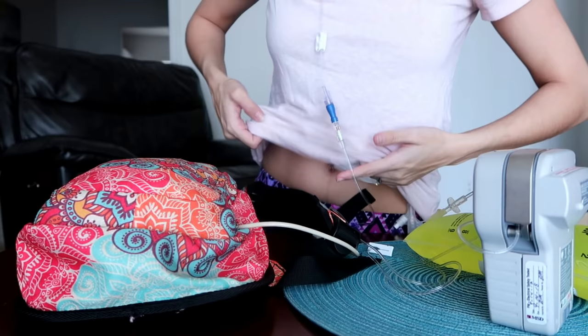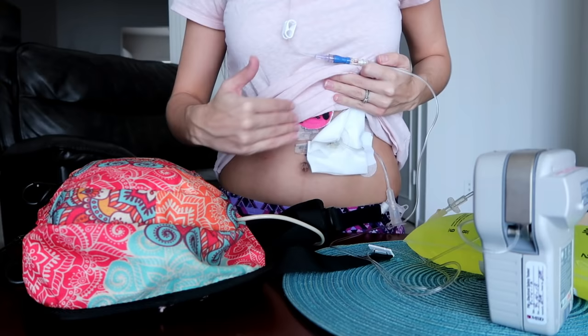Y'all may have realized I'm taping my tube this way now, as my surgeon suggested, to take pressure off of this side, and I'll be rotating where it's taped. Alrighty, feed's running, fluid's going. Harlow has been taken care of this morning. I'm gonna take a break, and I have an appointment with my home physical therapist this morning, so we shall see how that goes.